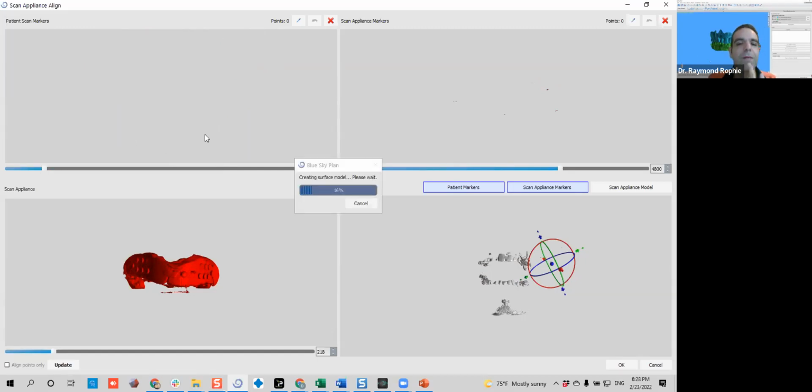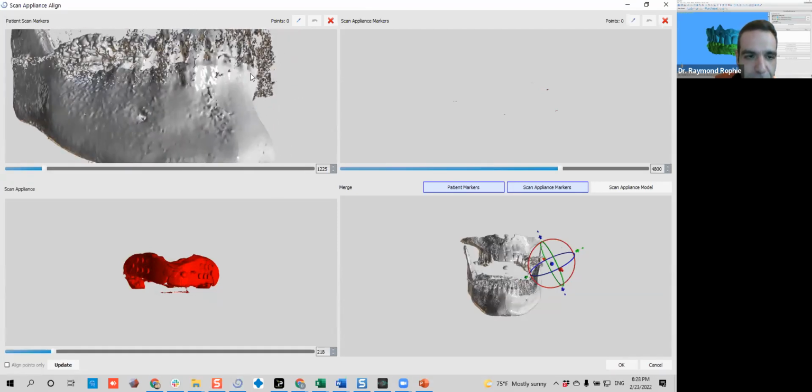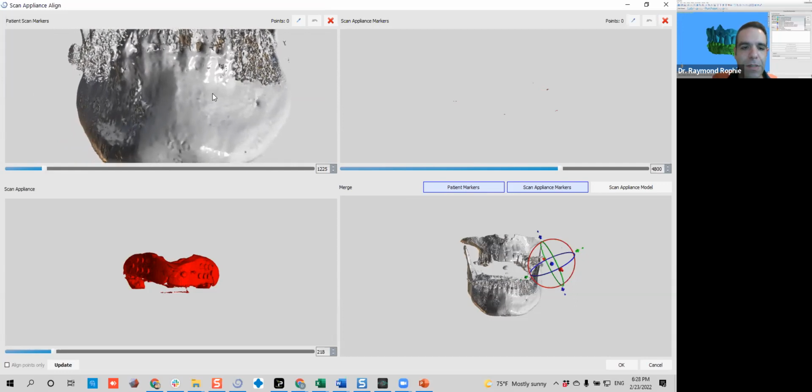with a movement line. And when you have movement lines on the CBCTs, it's very difficult to align the models with the CBCT. So whatever you do to keep your patient open, just make sure that it's a physical stop.